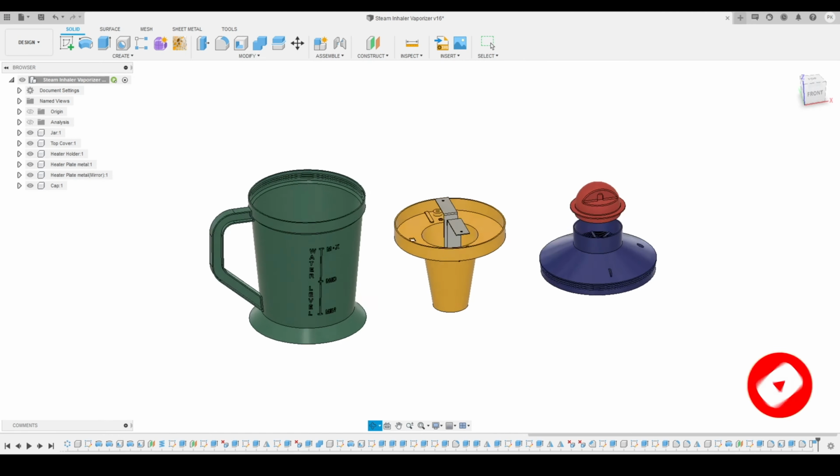If I expand my sketch folder over here in the design tree, you can see the small red icon here shows that my sketch is completely defined. If you are not seeing this red icon, this means that you have to provide a few more dimensions in your drawing. So just make sure that you have completely defined your sketches.